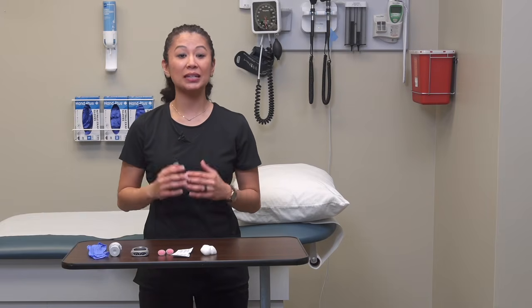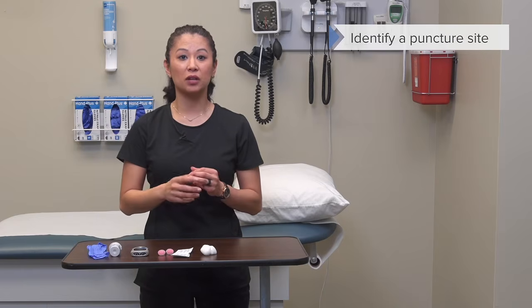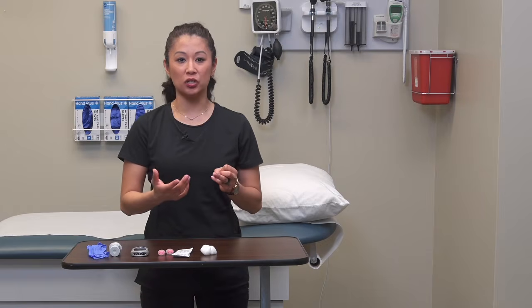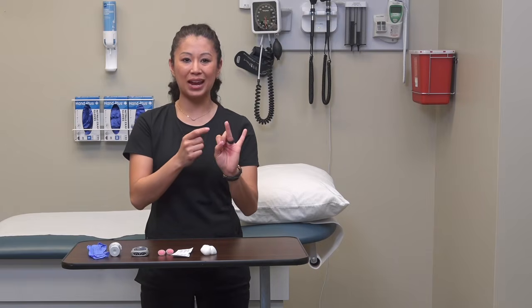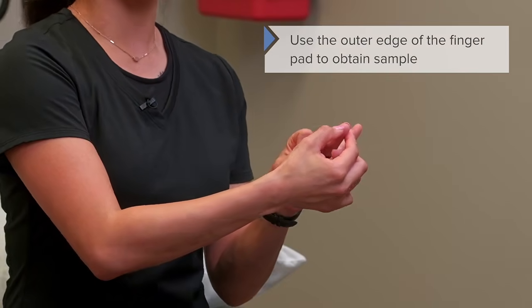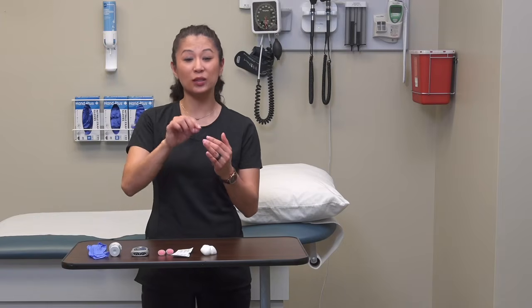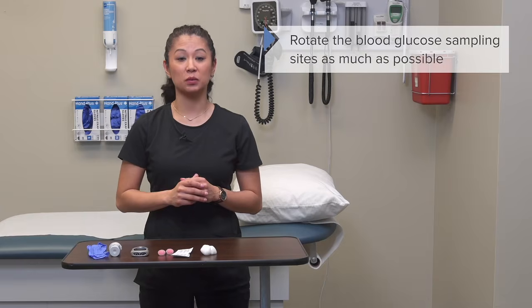Then we want to go ahead and identify a puncture site, and many times it's going to be your patient's fingers. So today I'm just going to use this finger here. Here's the other piece of this: when we do a puncture site, we're going to do our patient's fingers, but not the middle pad here. We're typically going to get maybe the soft, cushy side portion of their finger. Also note, if your patient's diabetic and has been poked a lot, you can see those little pin pricks, rotate sites as much as possible.